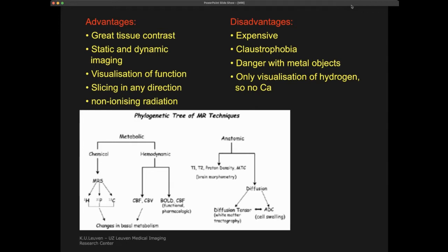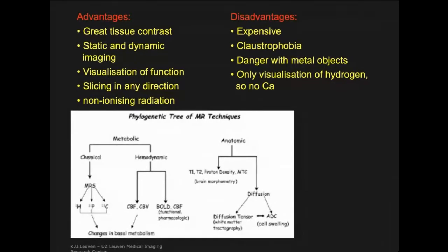This includes, for example, very small dental implants. Dental implants are rarely a problem unless you need to do imaging around the teeth. So mostly they will cause artifacts. They will rarely cause real danger problems, because mostly the metals they're made of are not too influenced by the scanner.